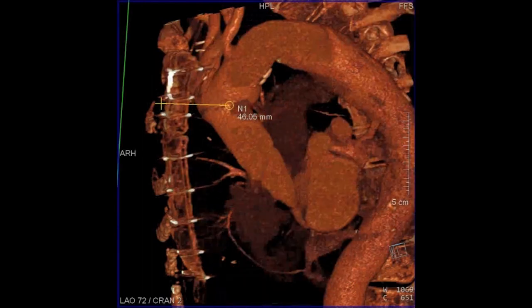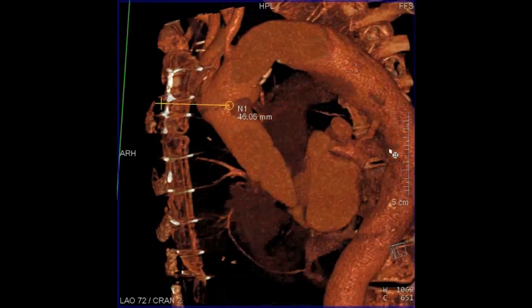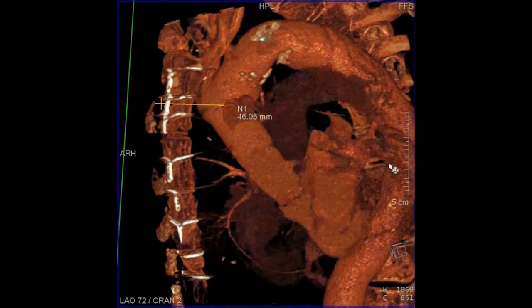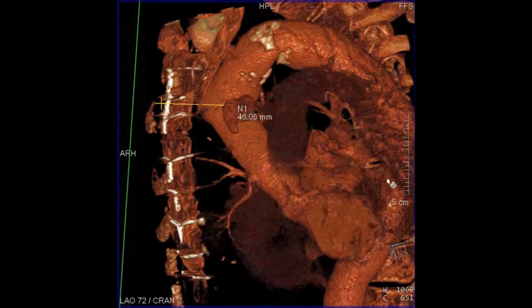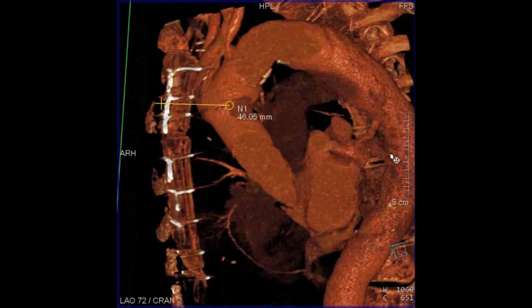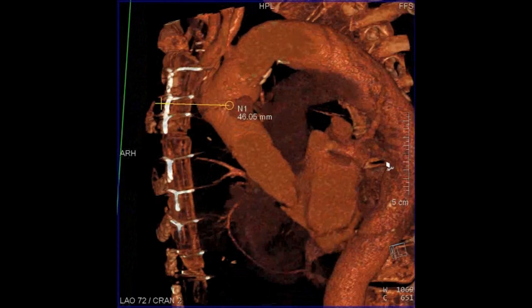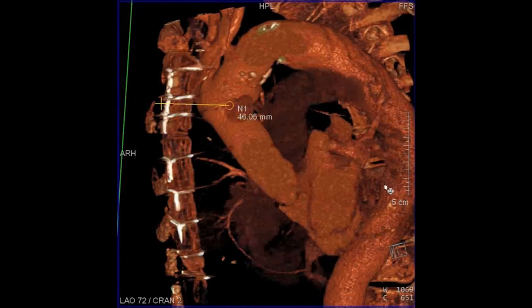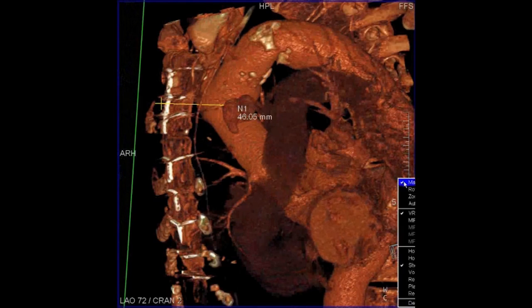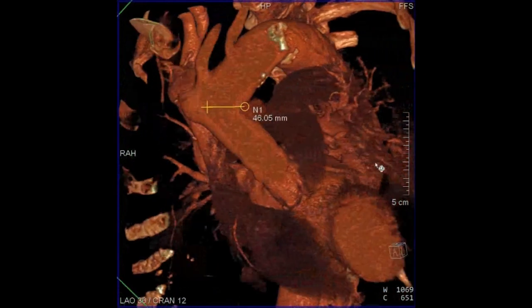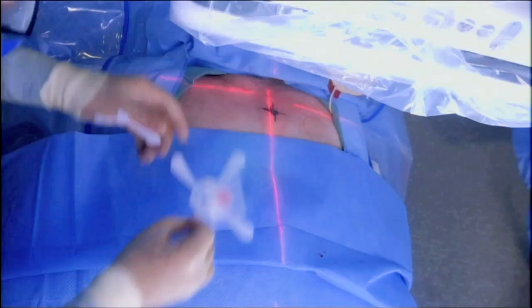Here you can see an image guidance system called iGuide, where we're planning the route from the skin into the pseudoaneurysm, measuring a depth of 46 millimeters from the skin. What was very helpful was the fluoroscopic visibility of the second and third sternal wires — a fairly easy approach, going directly between those sternal wires, straight posterior and into the pseudoaneurysm.